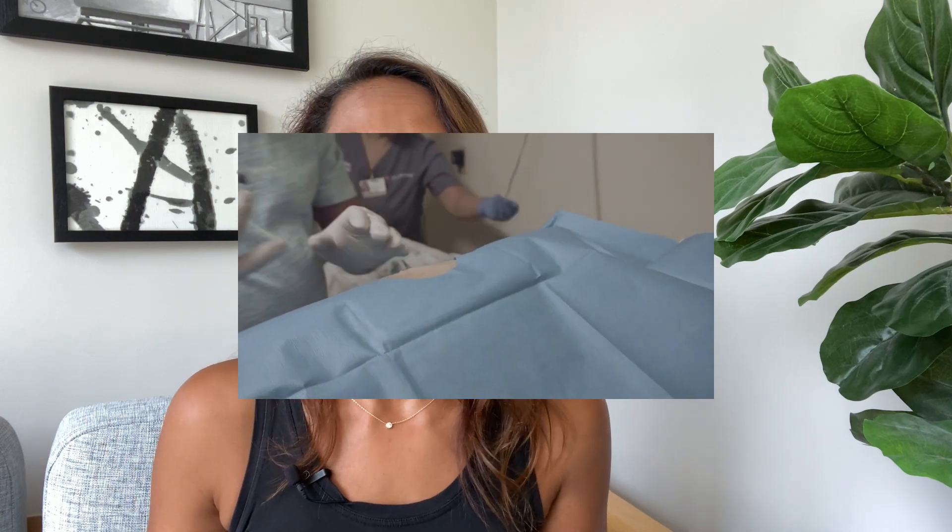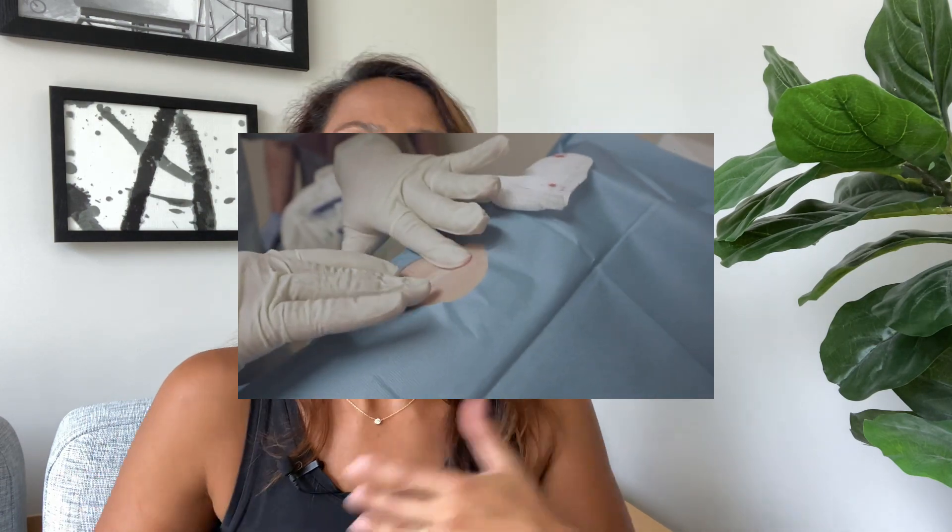Now let's talk about some downsides. The first con is that you need a small insertion made in your arm every six months, and some people are still having a hard time finding a doctor near them who can perform it. The medical professional must be trained to do the insertion, so you can't just go to any provider. On the Eversense website there's a form you can fill out to help find a healthcare professional in your area.